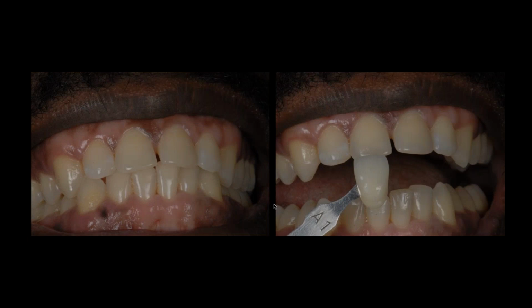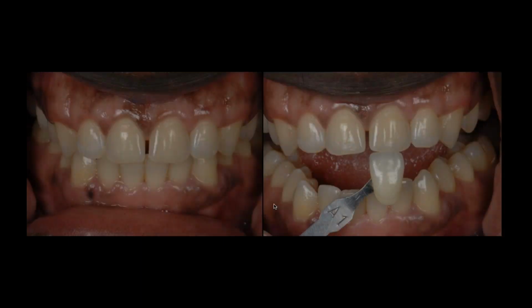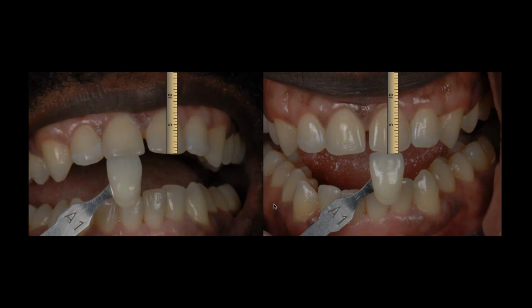The other thing that you'll notice is when you don't have the patient sitting or standing in the right position, you get what you're seeing here. This is a patient leaning back in a dental chair. The doctor is trying to get the angulation they want, and they put a shade tab there. Well, if I bring that patient here and take the exact same photos with them sitting or standing against the wall, look what happens when I compare those two photos.